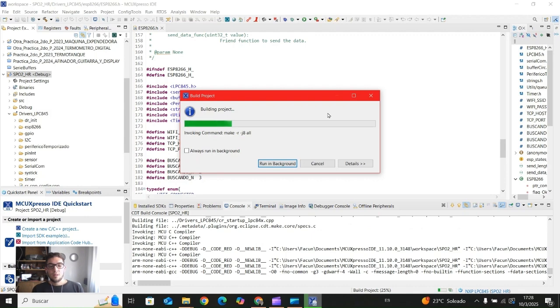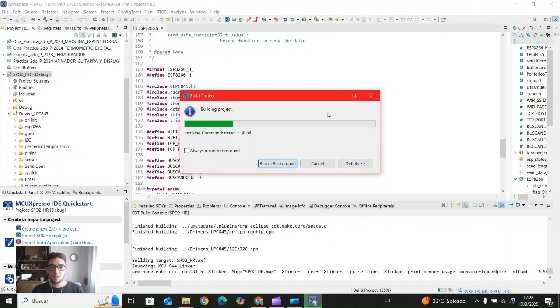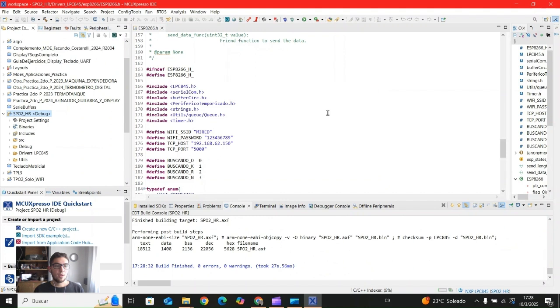And hopefully, well, when you import the project like this, it takes a few seconds to compile. Okay, now we successfully compiled it. We have zero errors and zero warnings. So this means that everything is ready to be used. You can change the files as you want. However, you're going to have the main configurations or main setups from the IDE already done.